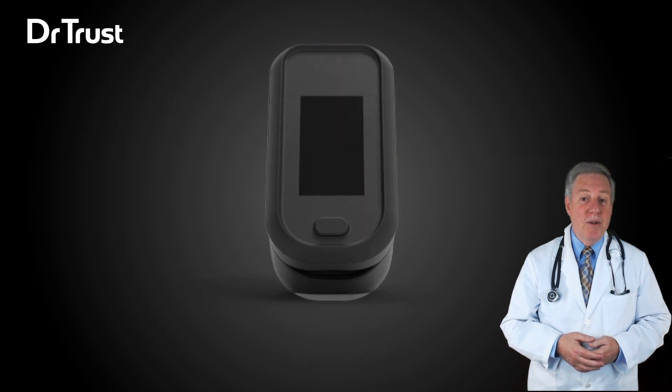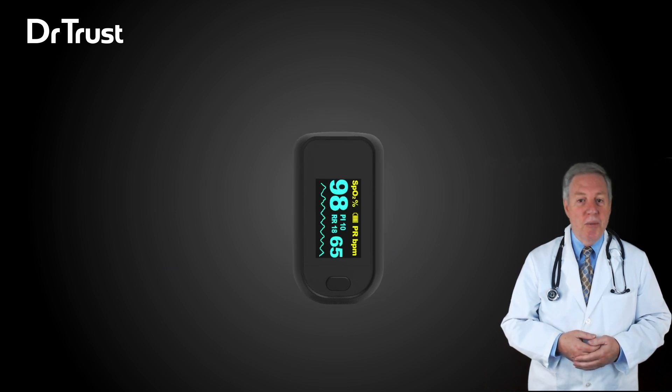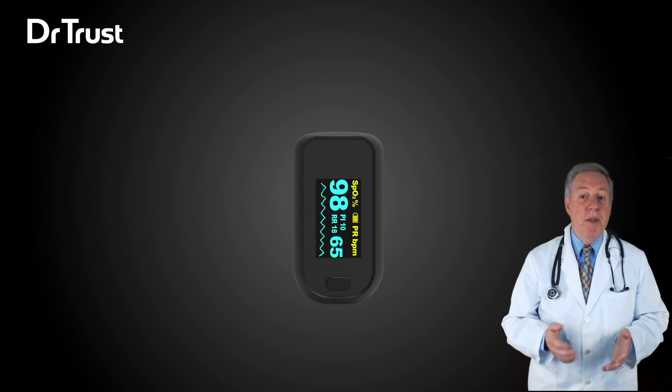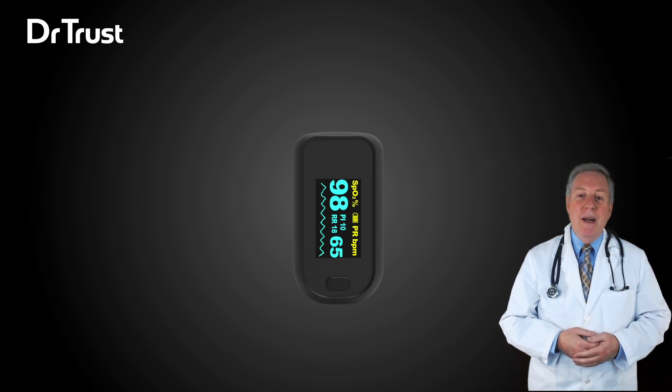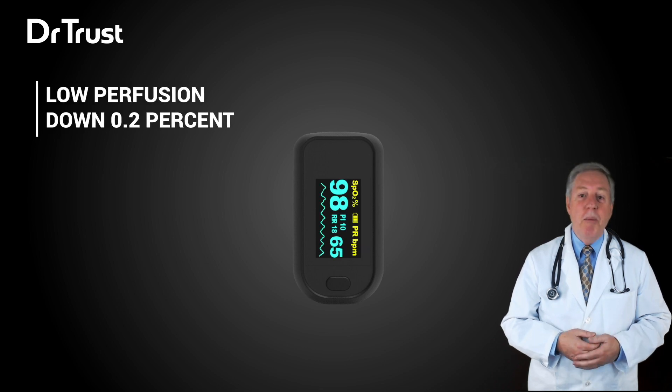You can manually adjust the direction of the interface. The colored OLED display looks brilliant and has simultaneous display for testing value and plethysmogram. The brightness can be adjusted from level one to five. The oximeter can measure low perfusion down to 0.2 percent.